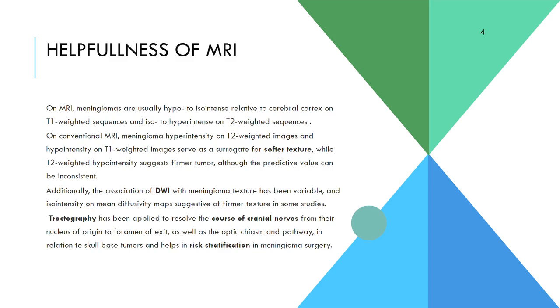Tractography has been applied to resolve the course of cranial nerves from their nucleus of origin to the foramen of exit, as well as the optic chiasm and its pathway in relation to skull base tumors, and helps in risk stratification in meningioma surgery.